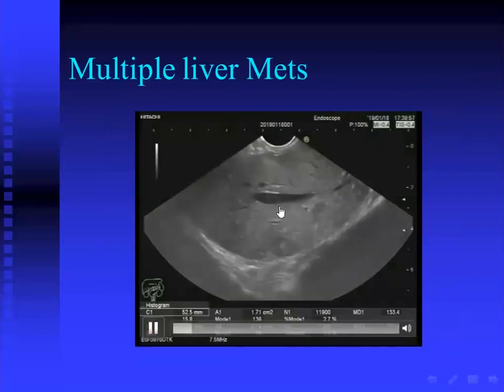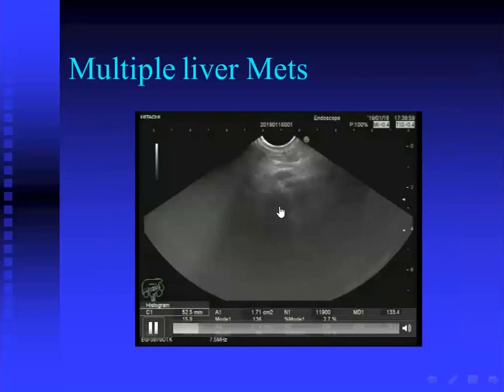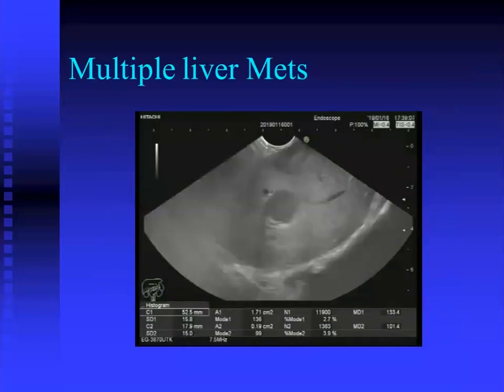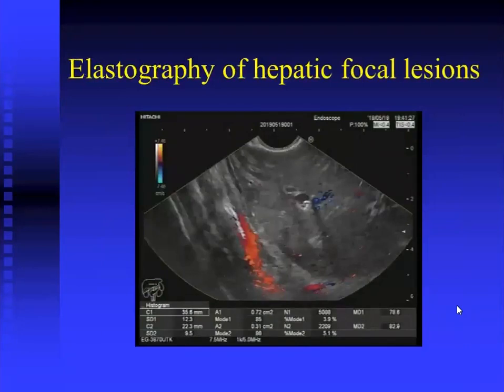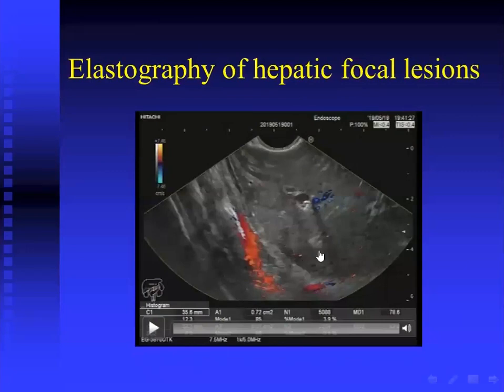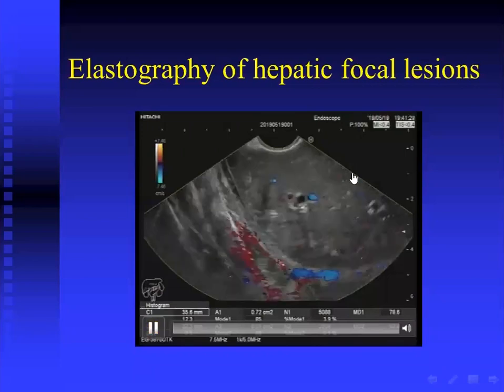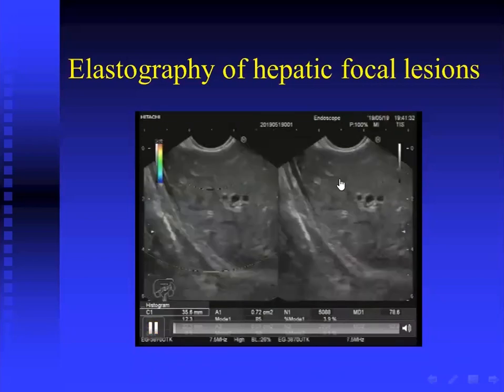There are multiple hepatic focal lesions, highly impressive of liver metastasis. We can also use our own weapon during endoscopic ultrasonography examination: real-time elastography, especially in hepatic focal lesions. In metastasis occurring in a normal healthy liver, the normal liver is very soft and the metastatic lesion is very hard, so the difference is very clear between the pathology and the normal liver. Elastography is therefore very accurate.